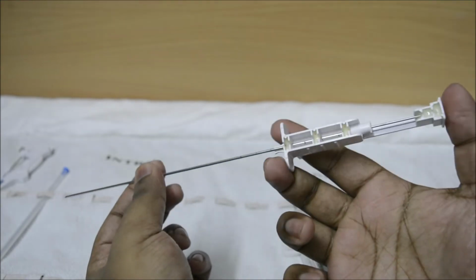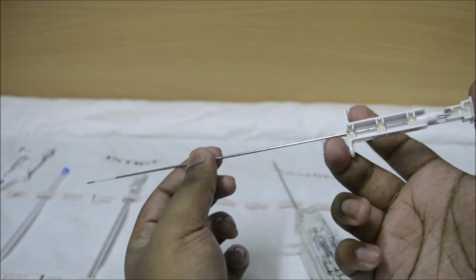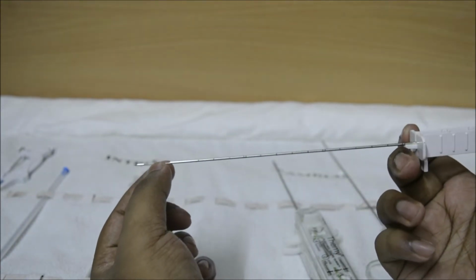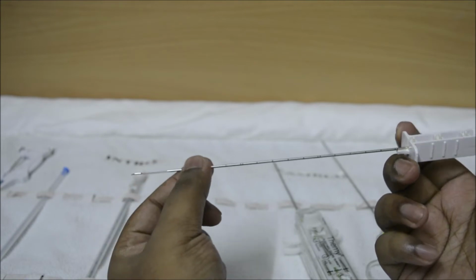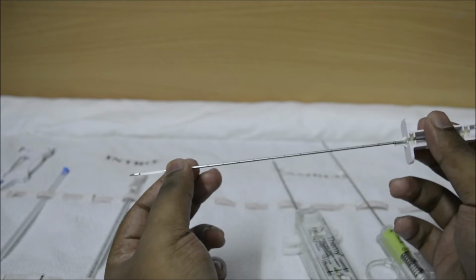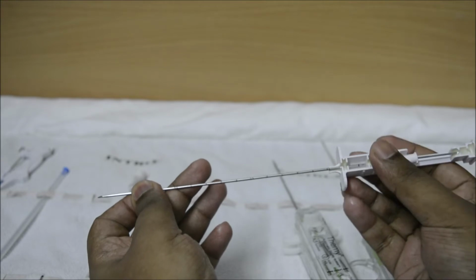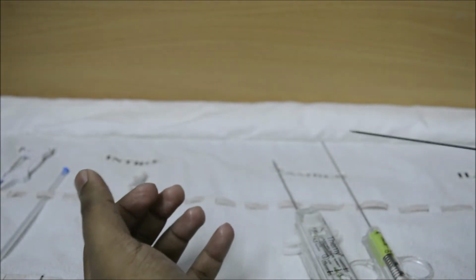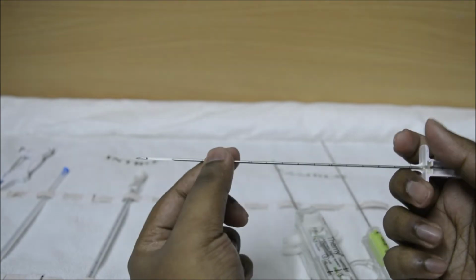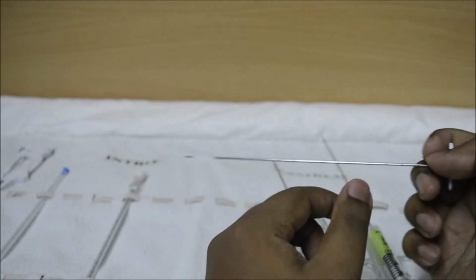So now this part of the needle, the trigger, is pushed. Now as you can see, as I push the needle, the sample collecting tray comes out of the needle cannula. Now the needle is moved a bit with a to and fro motion, and then the cannula is pulled again to close the collection tray. Now the needle is softly taken out, after which it is checked whether the sample has been collected by again pushing the cannula, and if the sample is collected, it is taken out with a scalpel from the collection tray.